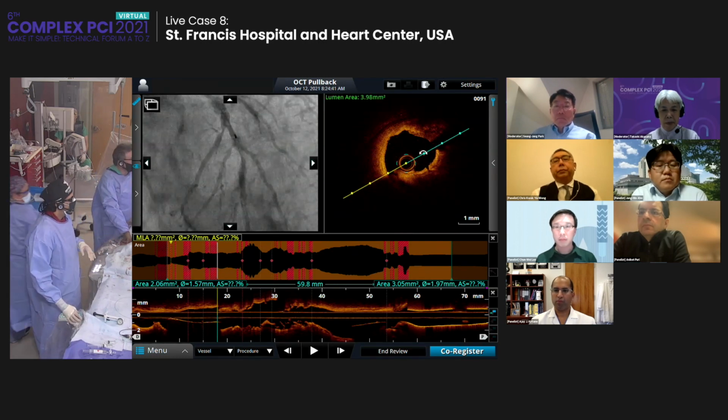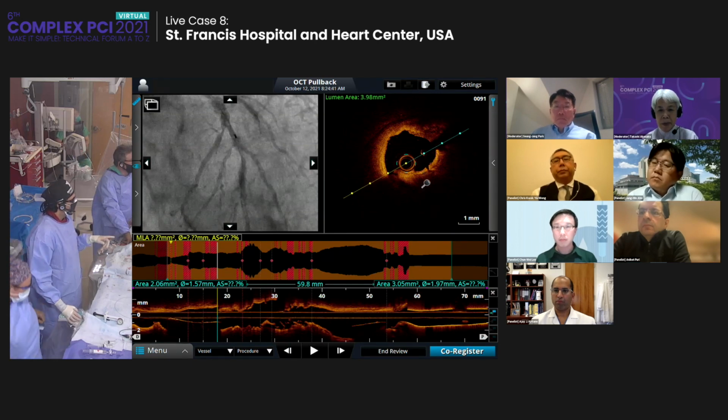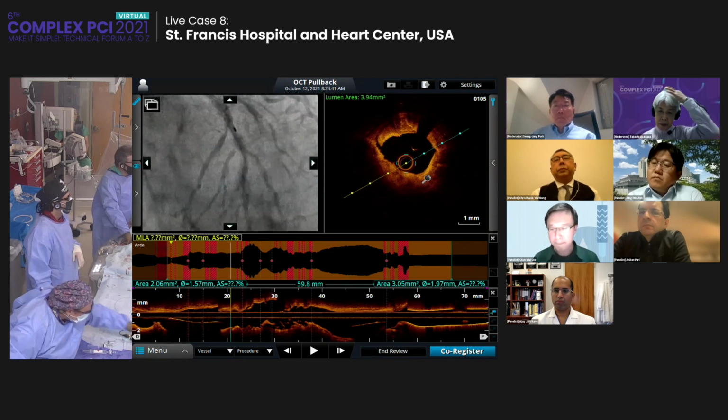And you can see a deep fracture right in the middle. Another little crack here. When we actually go up with the stent, you're going to see that this is going to fracture even further. So we're ready to stent.